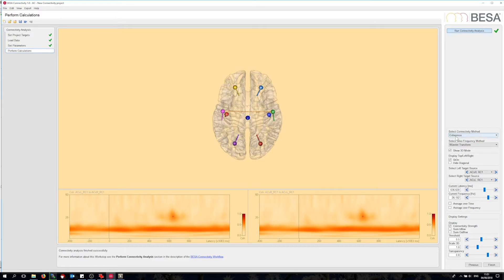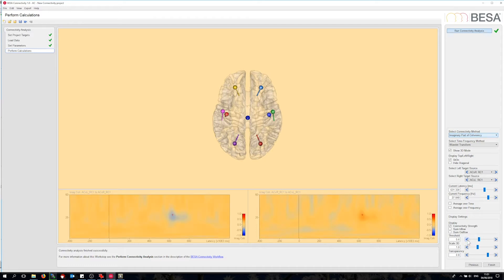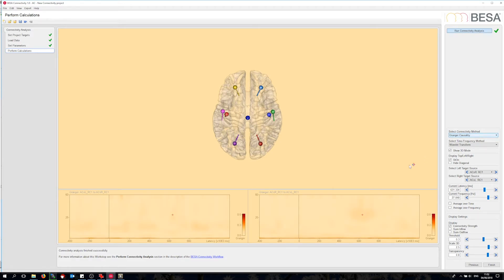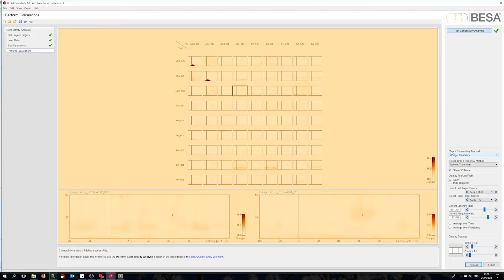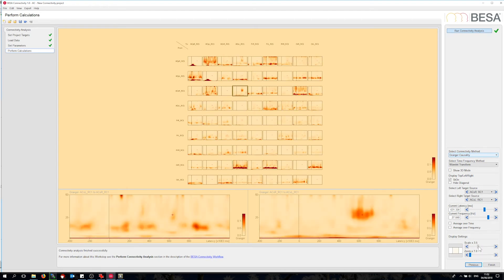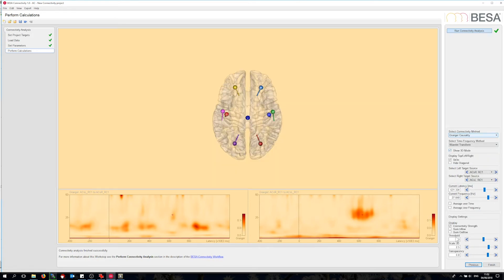Let me switch to imaginary part of coherency. I'll just change the scaling slightly to bring up the connection arrows. Now you can see that the right auditory area drives the left, something that was not evident from the coherence plot. How about Granger causality? This signal is somewhat weaker, but I can go back to the matrix plot to scale it up a little, then back to the 3D. I can see that the Granger causality gives me a similar result to the imaginary part of coherency.